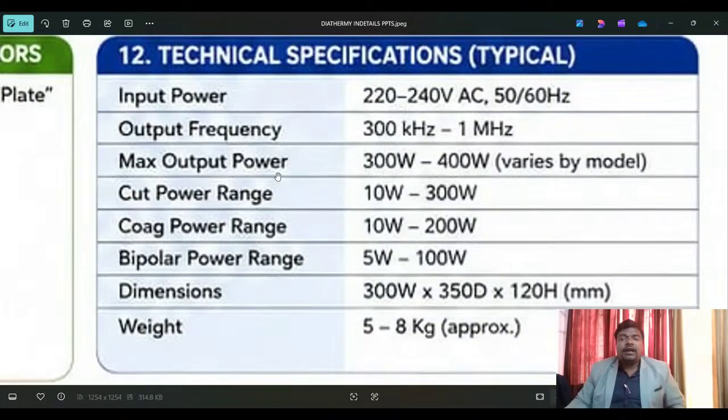Come here. Now going to the medical equipment. Okay, technical specifications. So requirements and specifications are important. Every medical equipment has specific technical specifications. So as a biomedical engineer, you have to follow a technically operated mind, then only can you resolve the issues and provide the services.